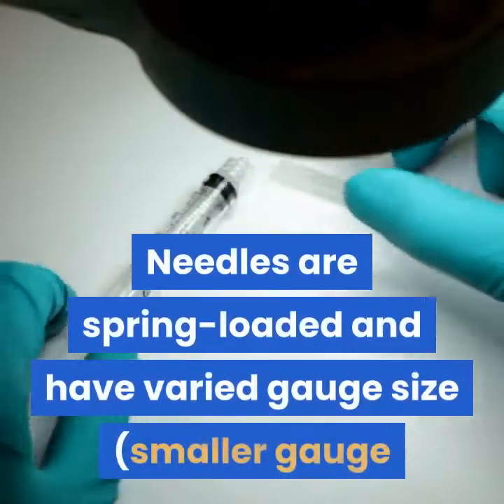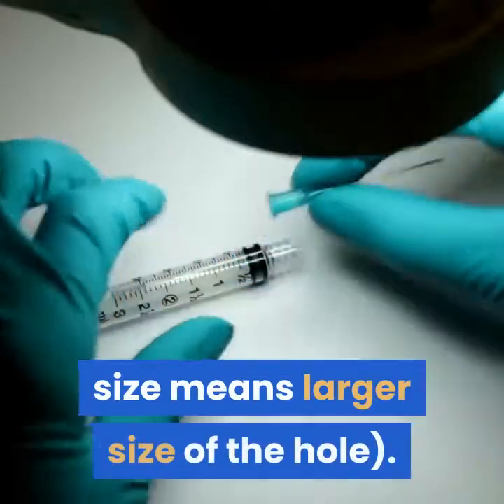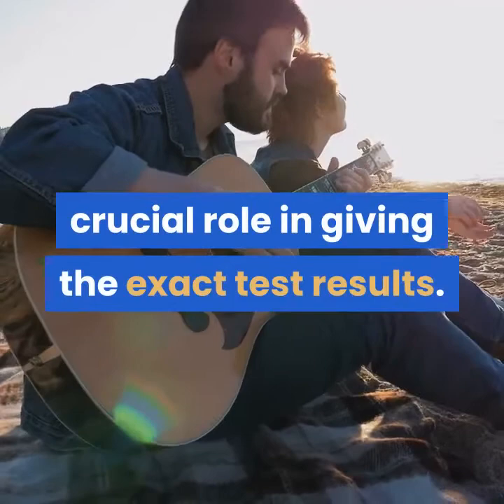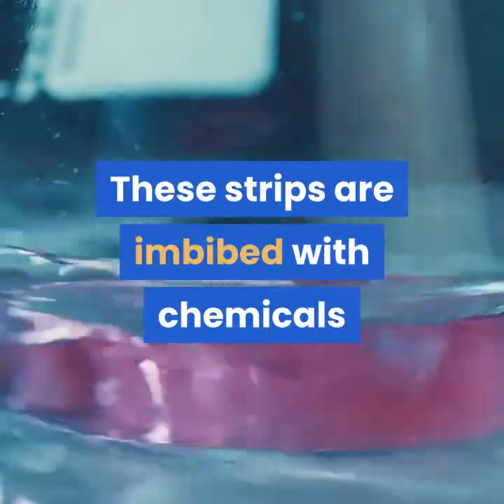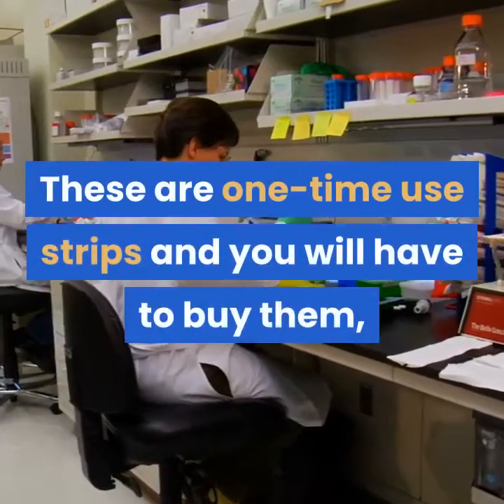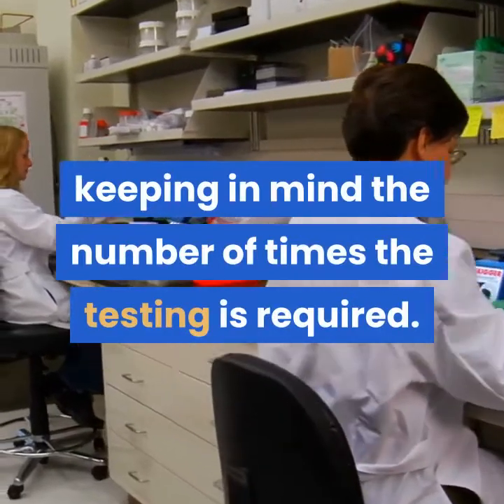Needles are spring-loaded and have varied gauge sizes — a smaller gauge size means a larger hole. The test strip plays the most crucial role in giving exact test results. These strips are imbibed with chemicals that help in sugar level detection. They are one-time use strips and you will have to buy them keeping in mind the number of times testing is required.